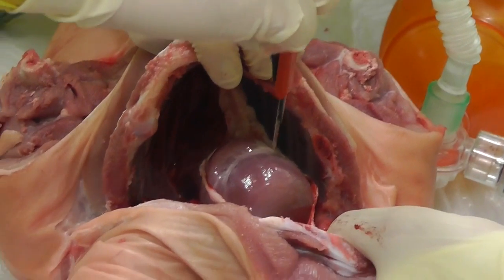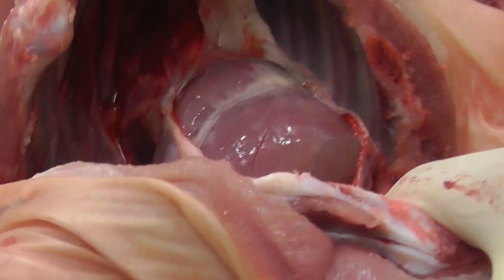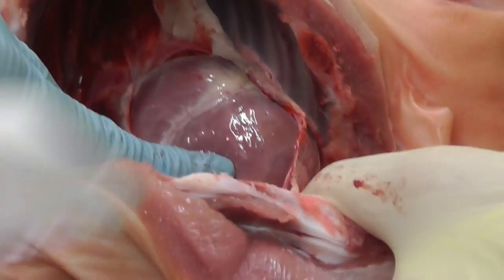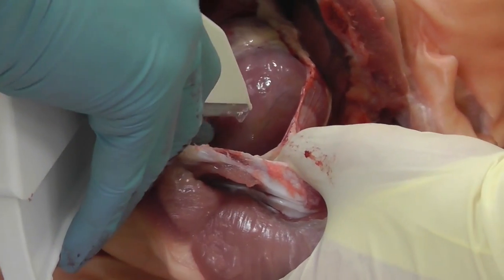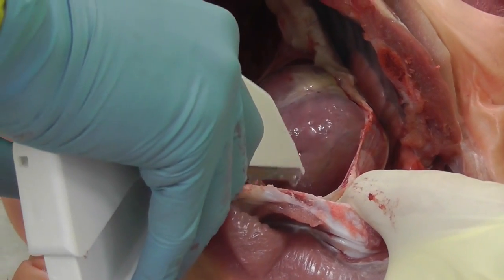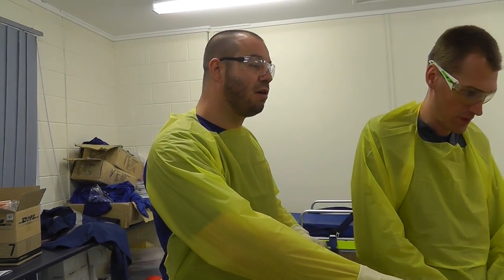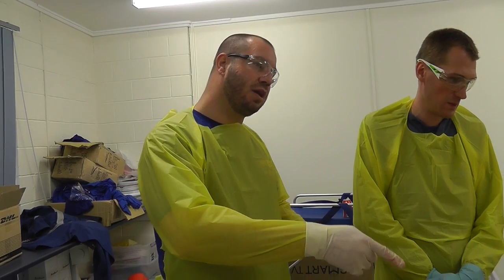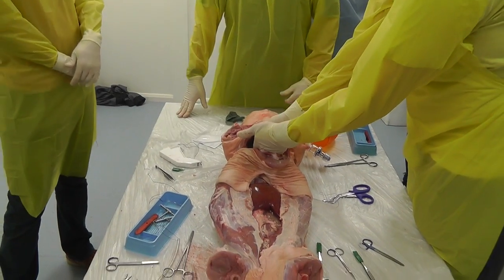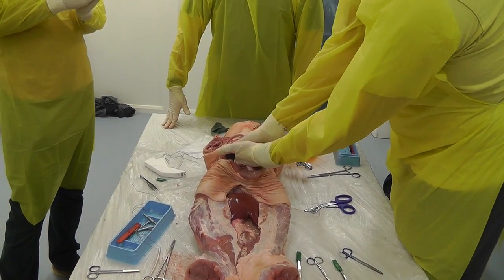This person has been stabbed. What are your options in dealing with that wound? Finger immediately — that is going to stop the bleeding — and then either sutures or staples. Have a play with putting a staple through that. Now, this was an 18-year-old male, but consider this as a six-year-old child. Think about the comparative anatomy and doing internal cardiac massage on a six-year-old that has been a bystander at an assault and has had a penetrating chest injury. Think about the human factors going through your head if you are doing a thoracotomy in a six-year-old.